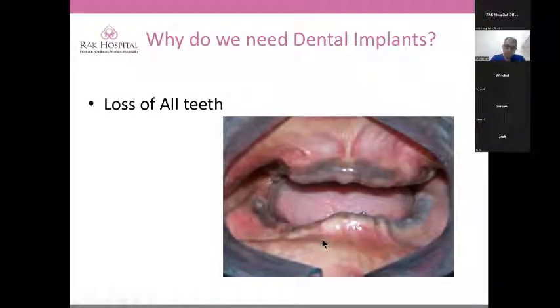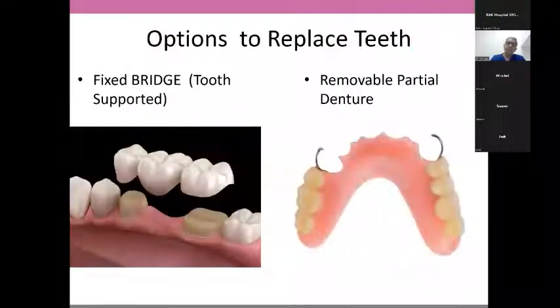Implants can be used to have artificial teeth which are replaced best. Coming to the replacement, conventional dentistry is a very old science, and we've been replacing teeth for many, many centuries. Commonly, you've seen these partial dentures, which are removable.